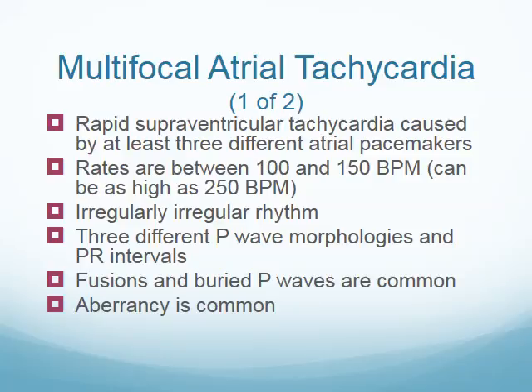So, kind of the sister to wandering atrial pacemaker is going to be our multifocal atrial tachycardia. What this is, is a rapid supraventricular tachycardia. Think about that terminology there. Supra means superior, and ventricular, obviously referring to the ventricles. So we know that this rhythm is arising from above the ventricles. It's not a ventricular rhythm.